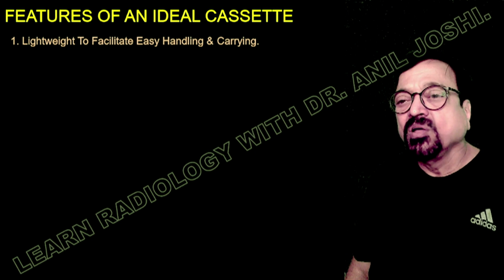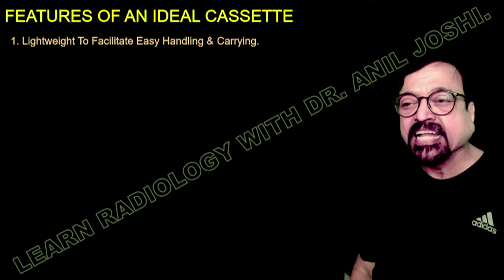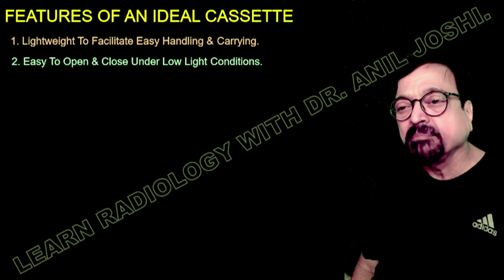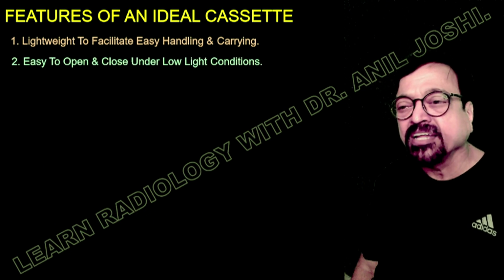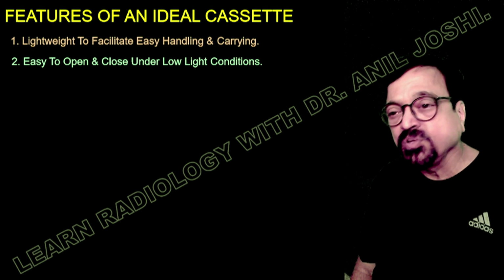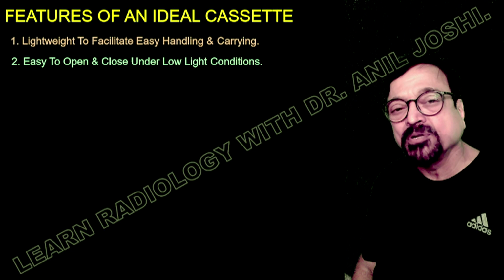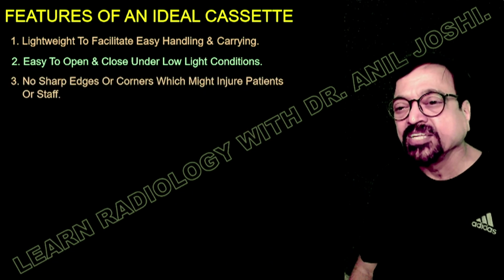Now, what are the features of an ideal cassette? It should be lightweight to facilitate easy handling and carrying, and definitely the cassettes were very lightweight because of the material used, mainly aluminum. Then easy to open and close under low light conditions. Often once you get used to it, you don't even need a safe light. You can just mechanically open the cassette, take out the film, put it on a hanger and put it in the developer. These were all mechanical things.